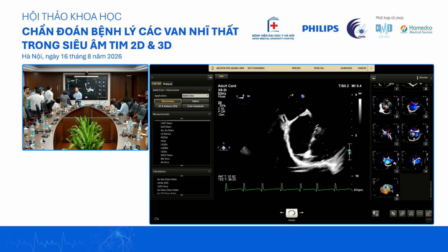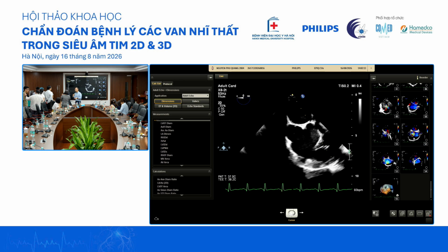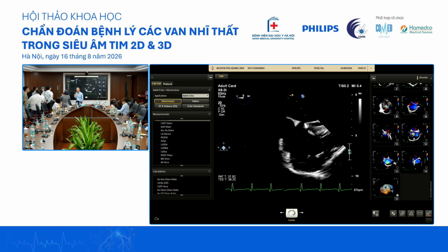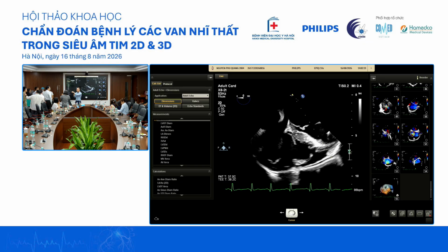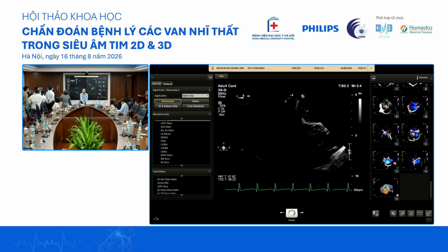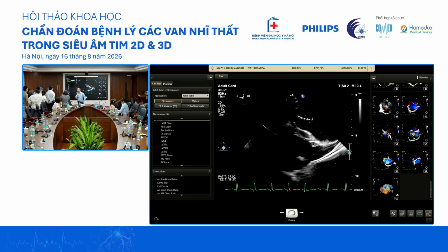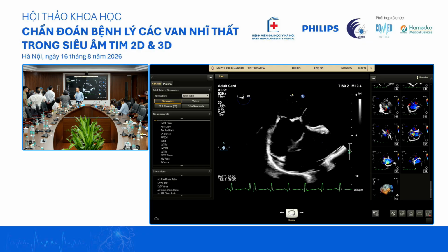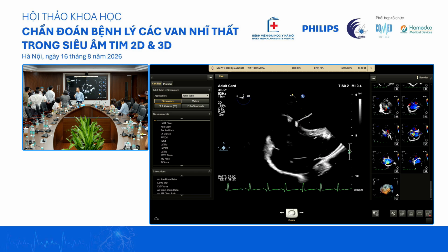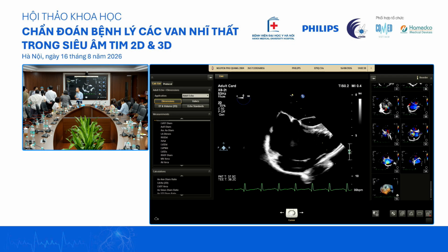Yeah. But we've done a PFO closure before, only to find out that the patient had a sinus venosus of the IVC. But this one, there's no abnormal flow. But if doing the right heart catheterization, you'll be able to see a step up, a step down, a step up. So if there's no step up, then you are very, very clear.